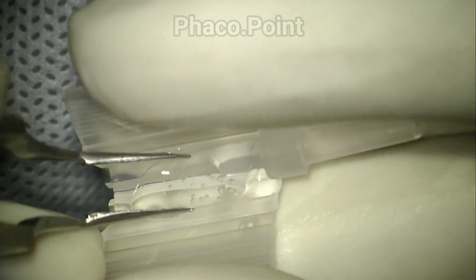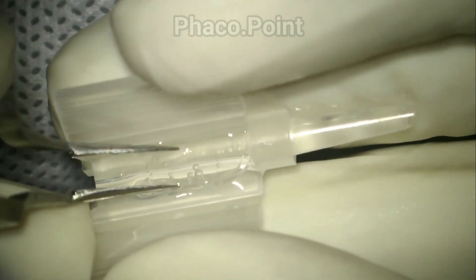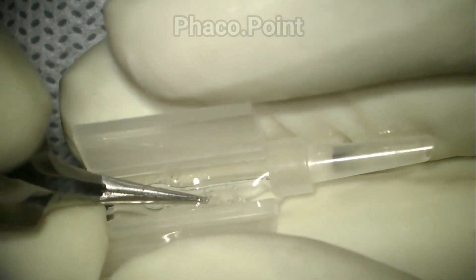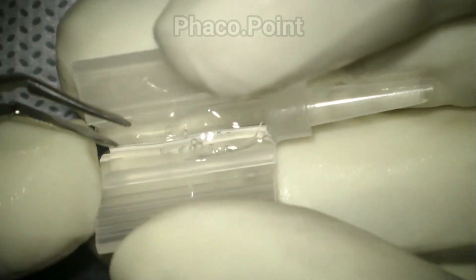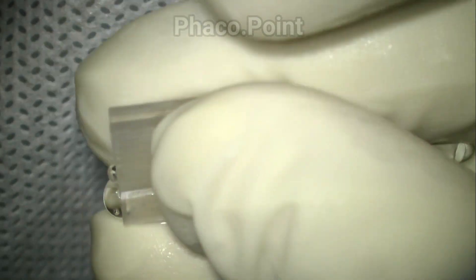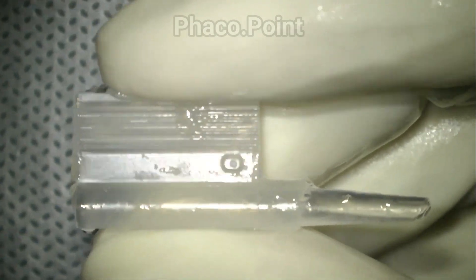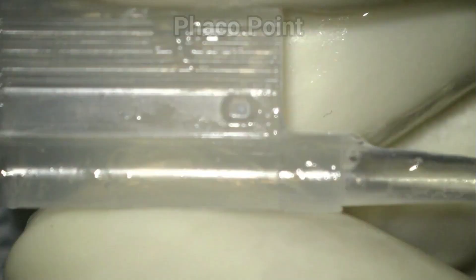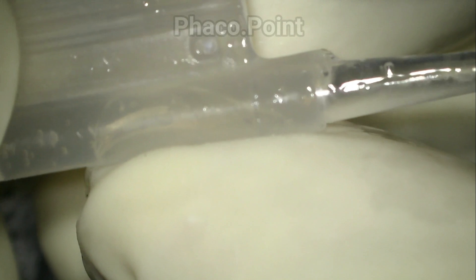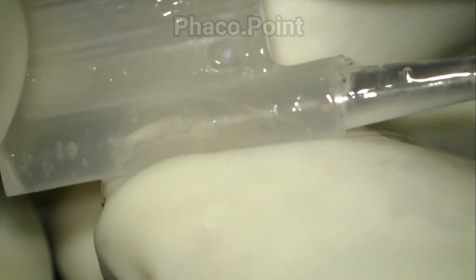The edges of the optic are first nudged into their place. Having achieved that, the surgeon ensures that the leading haptic is fine, then lifts up the trailing haptic and places it carefully within the body of the optic before closing the cartridge.